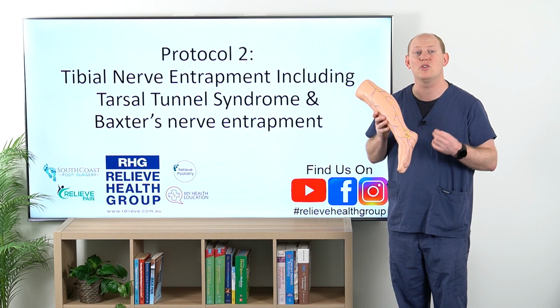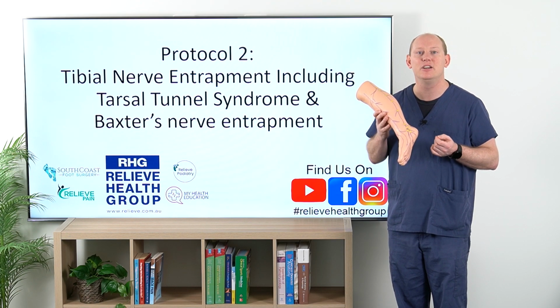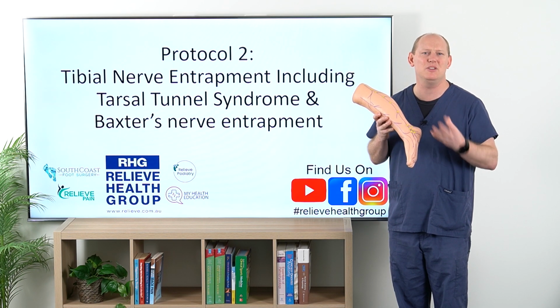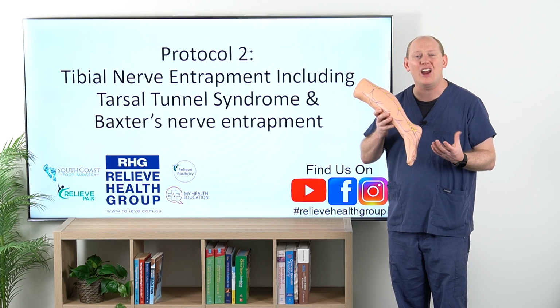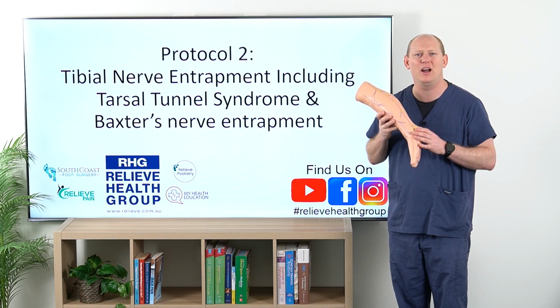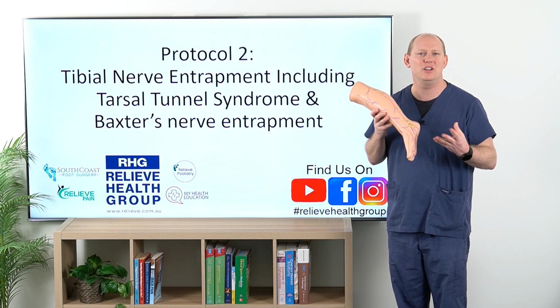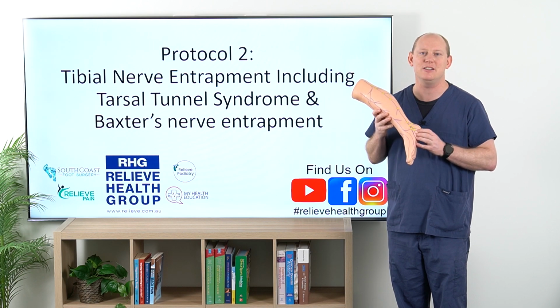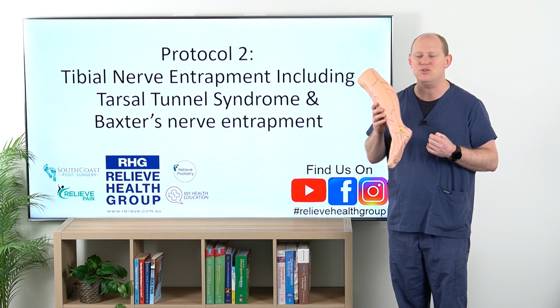Do consider whether a corticosteroid injection may be more appropriate as well, particularly if there's something like a ganglion causing that entrapment. It's a very good idea to image these types of patients beforehand, but at the same time, if you're staying superficial, it's quite a safe option to do. Do be aware of blood flow and vascularity, particularly as that can cause some of our tarsal tunnel syndromes, and you're wanting to really try to avoid any of the veins or the vessels in that area. Of course, as always, we're injecting as we're entering the skin to reduce the chance of too much bleeding or nerve injury as well.